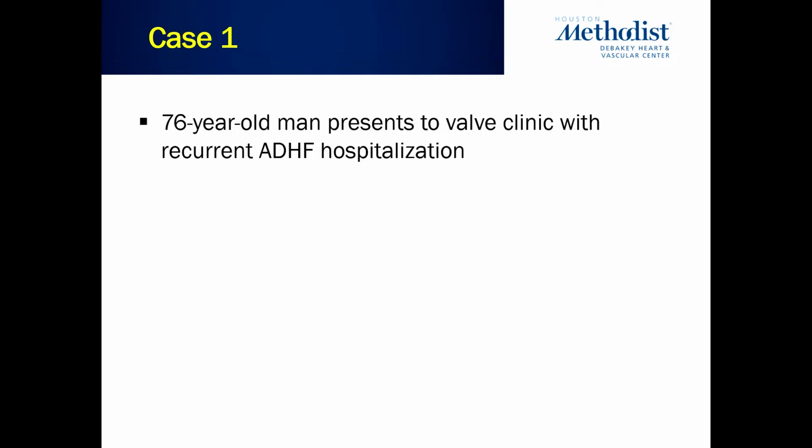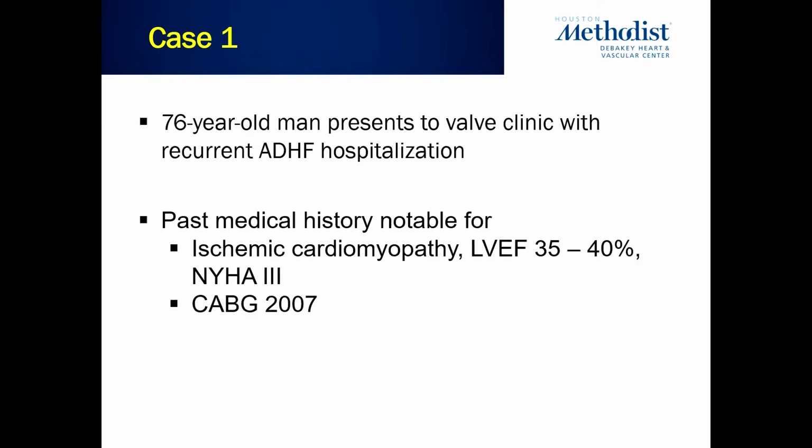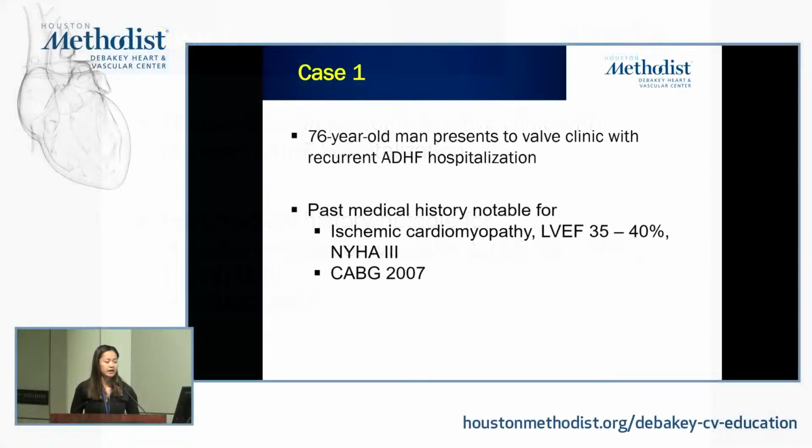Case number 1. A 76-year-old man presents to Valve Clinic with recurrent heart failure hospitalization. He has a past medical history notable for ischemic cardiomyopathy. The LVEF is 35 to 40%. He has NYHA class 3 symptoms, and he has a history of CABG back in 2007.